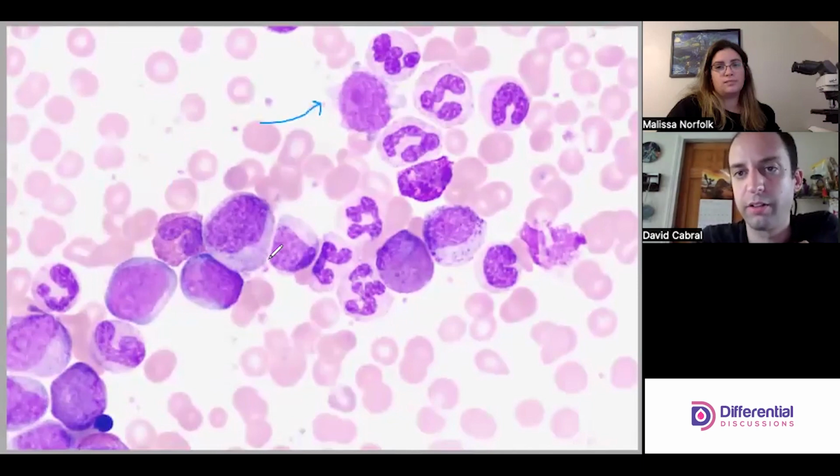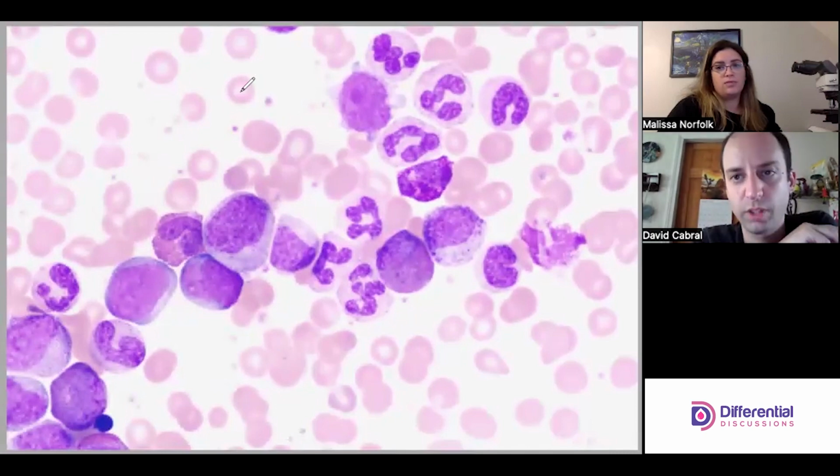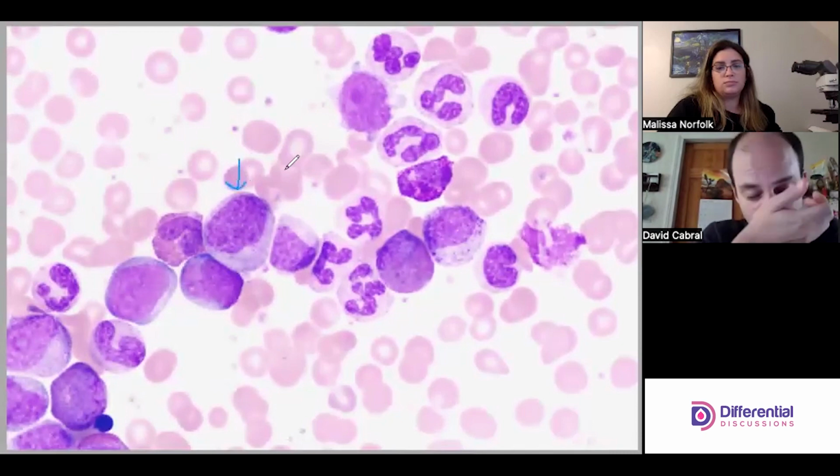All right. What else do you think might be worth our time to spend? Honestly, I think folks struggle with the immature grans, so I think even just talking about them would be helpful. That's fair. Hit this one. That's beautiful. I would say we've comfortably transitioned to a myelo here.